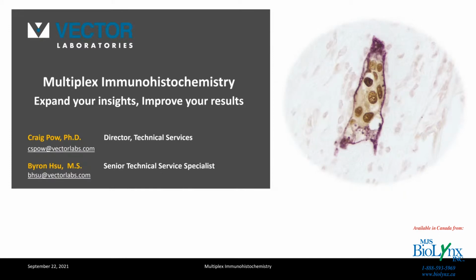So I'm giving a definition here of multiplex immunohistochemistry. This is the same thing as calling it double labeling, or triple labeling if you have three labels on the same section.